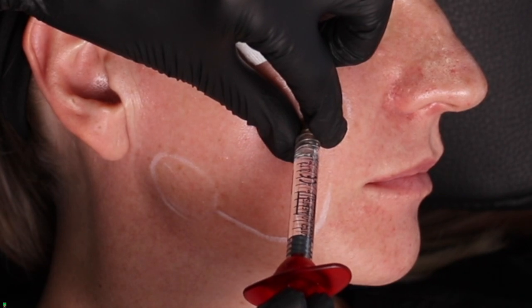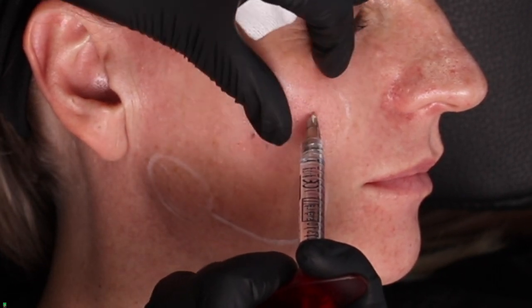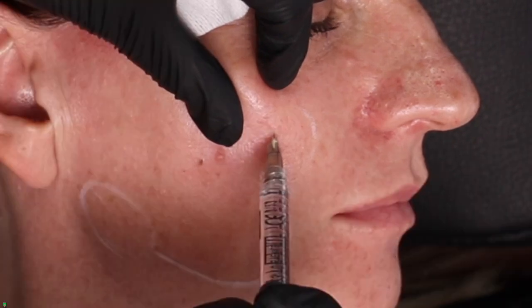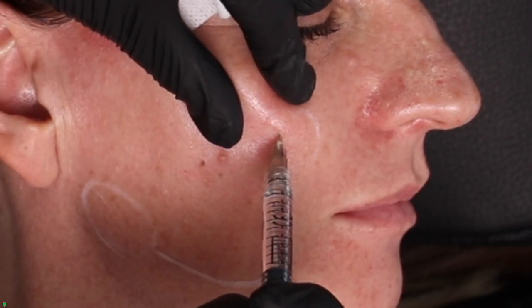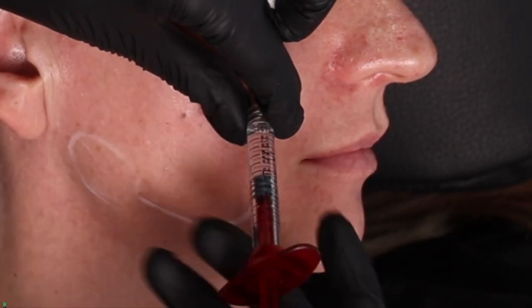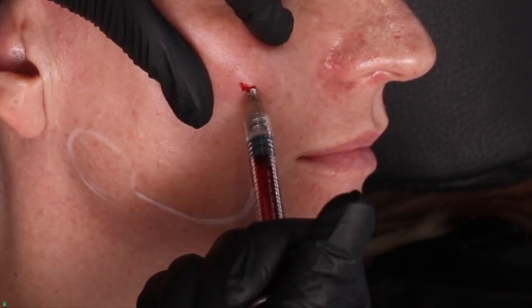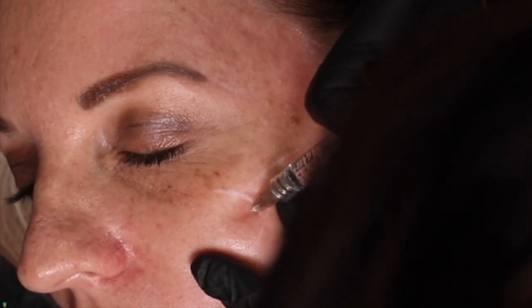So let's start with the needle technique. This demonstrates the anterior medial technique, where we first aspirate, really making sure that you're not inside a blood vessel. Then after a negative aspiration, we do a bolus technique of injection, but at all times we are watching the skin perfusion. We are checking the area to see if there are any problems with capillary refill.